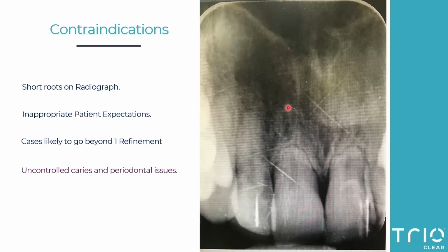So there's a lesson here regards taking x-rays. For sure, I nearly always supplement my radiographs on clear aligner cases. If you take an OPT, they're good, but sometimes you can lose a little bit of focus and clarity on an OPT, so I nearly always supplement them with an IOPA. And I've never regretted it. They're really important. We do still observe quite a number of cases coming in through the Trio Clear platform without x-rays. And we always make an assumption that they are taken somewhere but just not uploaded. But please do take an x-ray on all your cases. It's really important.